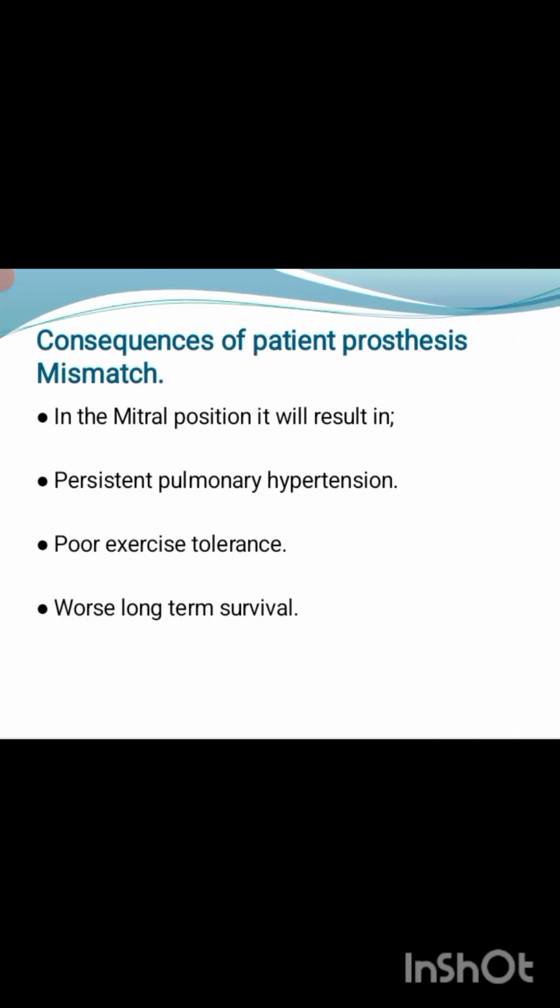Consequences of patient prosthesis mismatch in the mitral position: it will result in persistent pulmonary hypertension, poor exercise tolerance, and worsening long term survival.